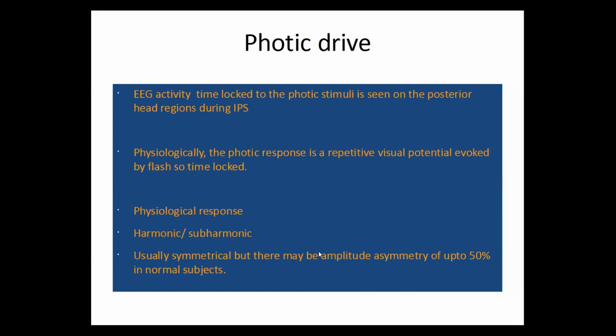What is a photic drive? Photic drive is the EEG activity which is time locked to the photic stimulus. That is, whatever frequency you are giving in photic stimulation, you will get changes in the occipital region with a similar frequency. So the occipital region is driven by this photic stimulation.